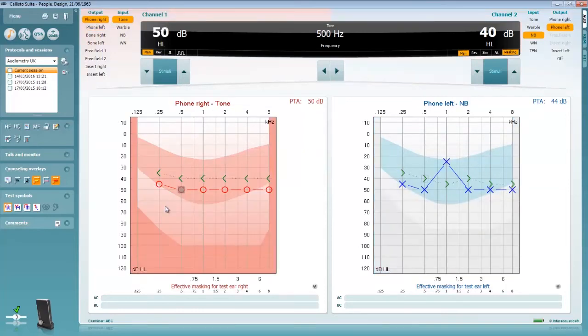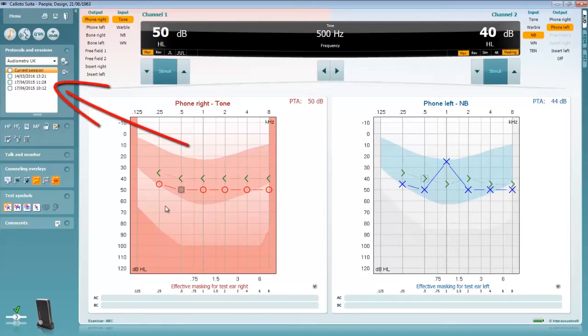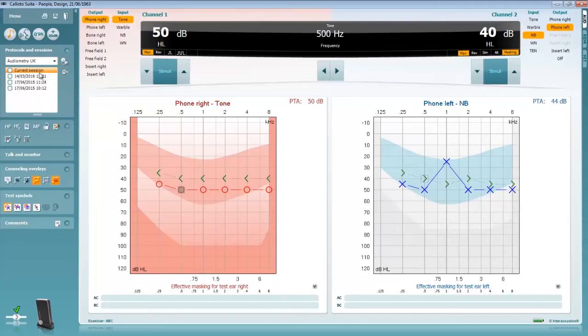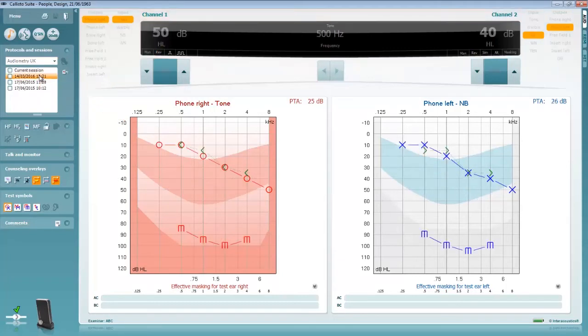Underneath the protocol selector is a session browser. All testing must be performed in the current session but you can use this drop down to review older audiometry sessions which have previously been created under this patient. This includes sessions which may have been performed on non-Interacoustics systems.